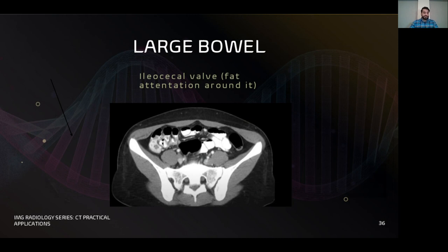All right. So with the small bowel, remember that it kind of transverses across, again, goes back into the right lower quadrant, not the left. I think I accidentally said the left before, but it's the right lower quadrant, and joins into the cecum in the right lower quadrant. From there, cecum and appendix, but into the cecum through the ileocecal valve, and then the ascending colon. And so there's the ileocecal valve right there. We're going to talk about trying to find the appendix in just a minute, because when you look for the appendix, there's different ways people use, but a good way is using the ileocecal valve as a checkpoint and progressing from there, essentially.